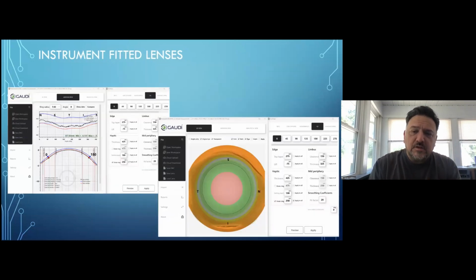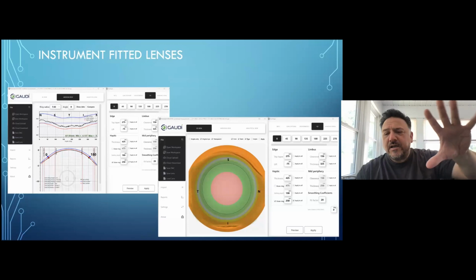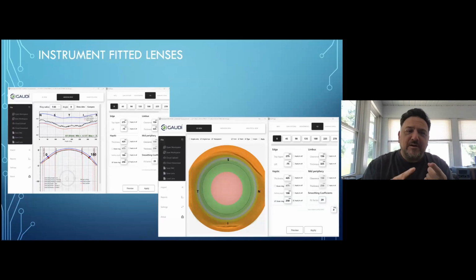Again, another example, some of these programs can be very sophisticated. You can take a very complex eye and you can create a very unique, uniform, free-form lens for that eye. And then once that lens has been ordered and dispensed, this gets back to this whole modification process. I said before that the whole process that's different is getting to that first ordered lens. And that is true. Once we have a first ordered lens, it's all about understanding the eye and making the right modifications. But how you make those changes is different, whether I'm calling up a consultant and telling them what I need, or whether I'm going into a software program and making adjustments within the software to change the lens in a way that I need. Ultimately, it's still you making those calls, but it's how you communicate that information to the lab.